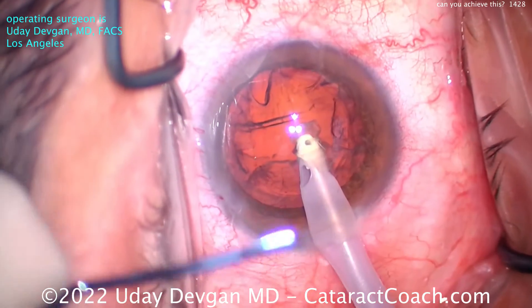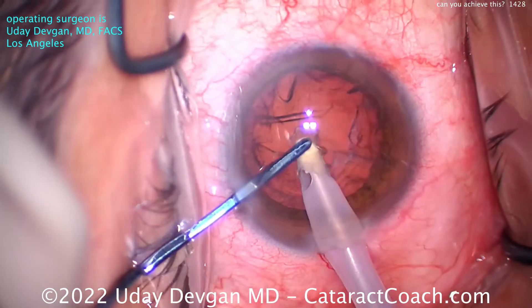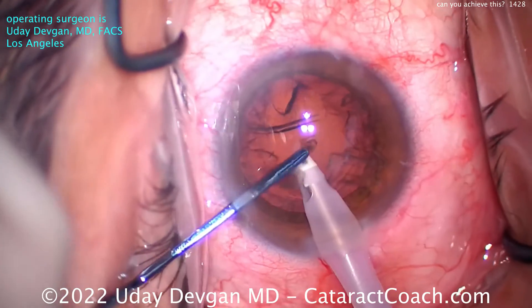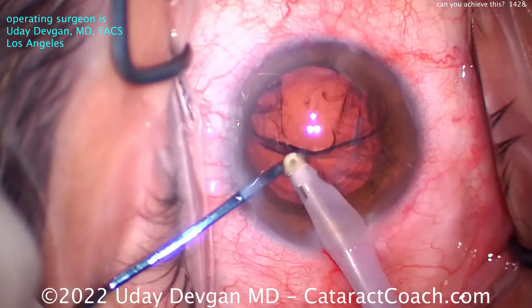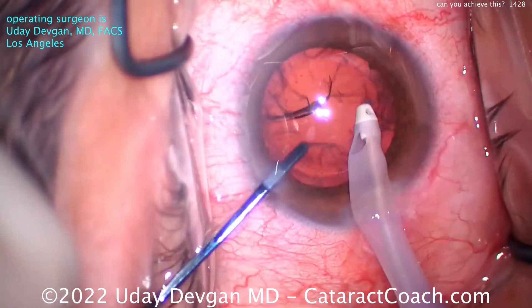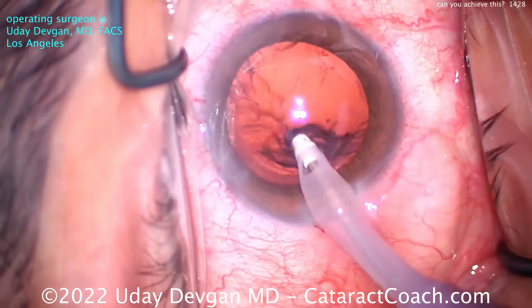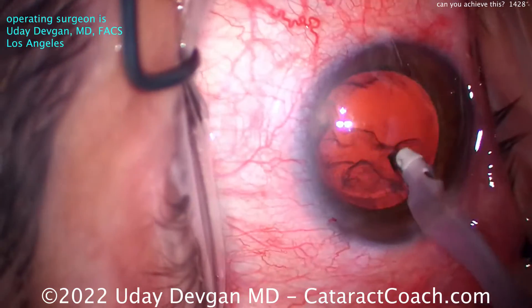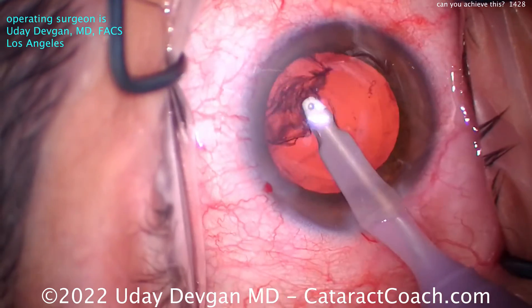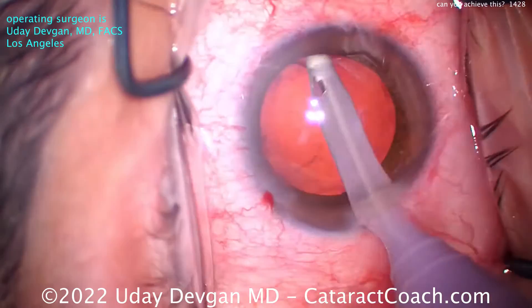Now taking out the cortex, you'll also notice the position of the incisions looks pretty good. The incisions are barely nicking limbal vessels, so you know they're going to seal beautifully. The incision architecture is good, so I'm confident they're going to seal nicely, even initially, and be watertight. For cortex removal, I'm going more circumferentially — I don't really pull too much radially, it's more circumferential. And now it's pretty well cleaned up.